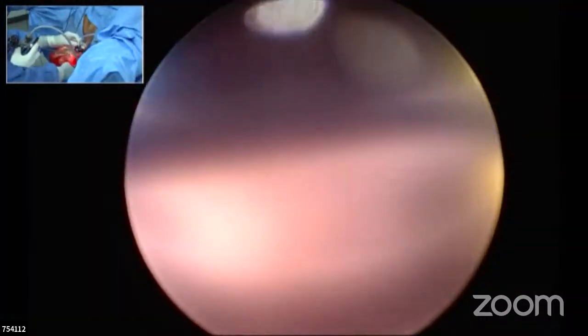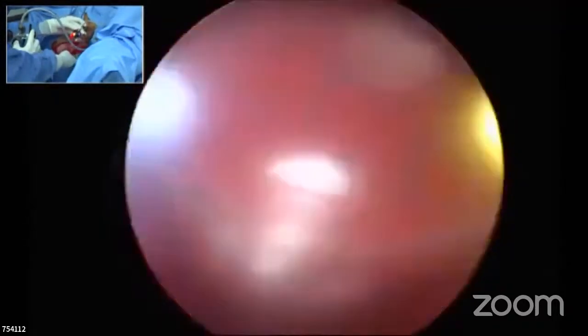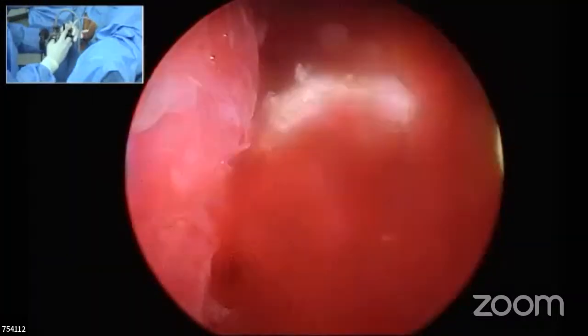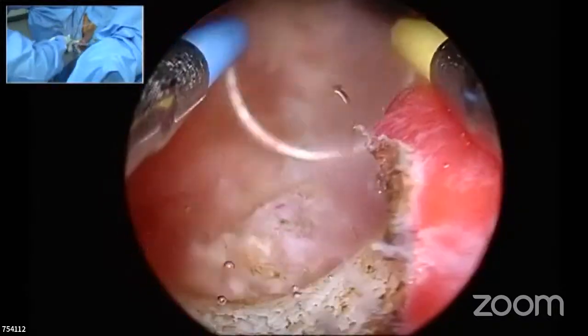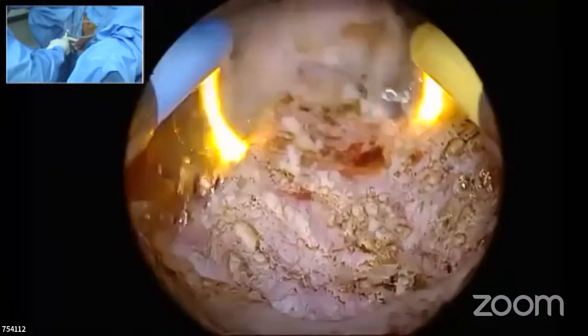If you do it fast, the actual hemostatic effect of the bipolar is lost. So correct, I tell you, absolutely true, sir. When you do it very slowly, the hemostatic effect will be very good. So I'll show you one when I'm doing it. If I start cutting this tissue very slowly, the hemostatic effect will be very good. That's absolutely true. No doubt, sir.